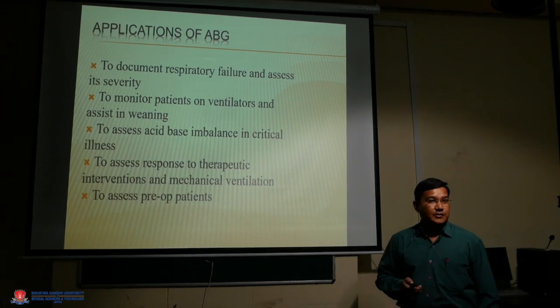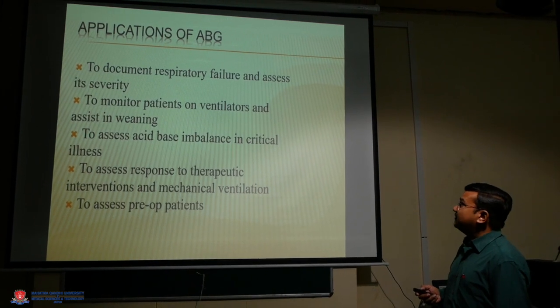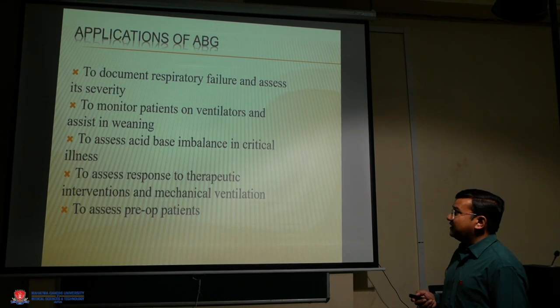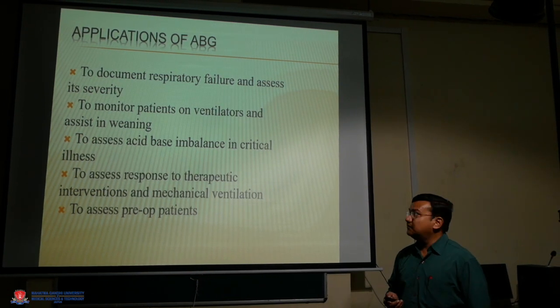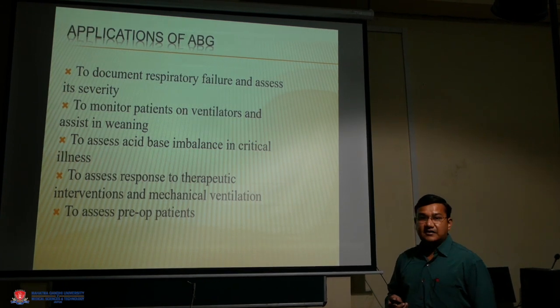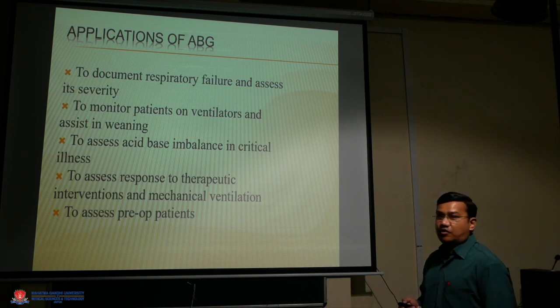So why is ABG actually required? ABG is required to document respiratory failure and assess its severity, to monitor patients on ventilator and assist in weaning, to assess acid-base imbalance in critical illness, to assess response to therapeutic interventions and mechanical ventilation, and to assess preoperative patients.